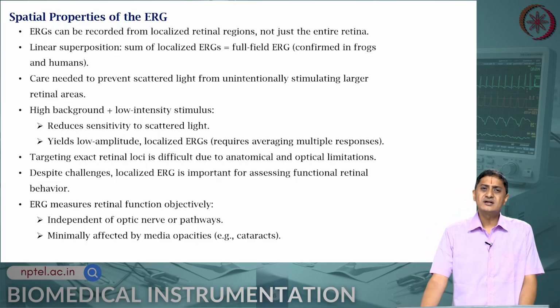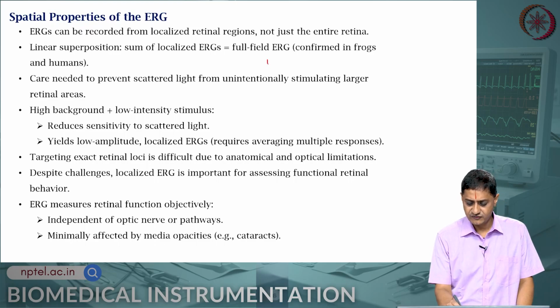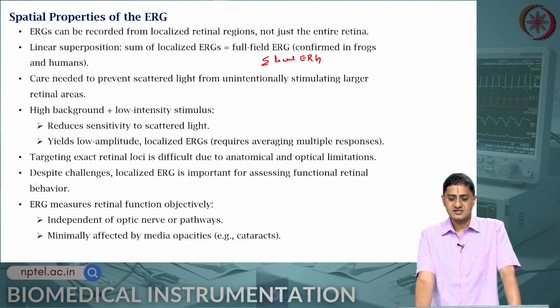Also, you can record ERGs from localized regions of the retina, not just the entire retina. So, essentially full field ERG is the sum of the local ERGs due to linear superposition. This has been confirmed in humans and frogs.